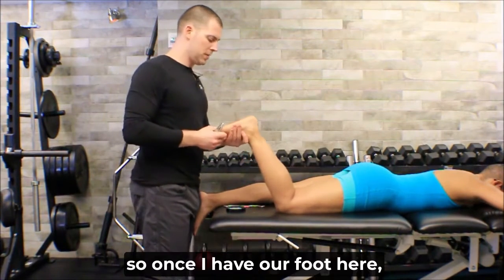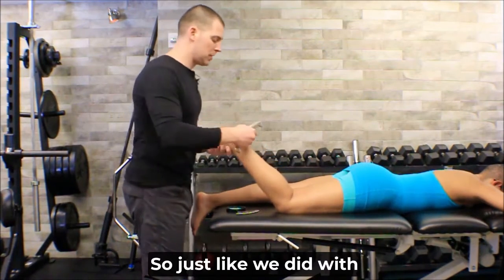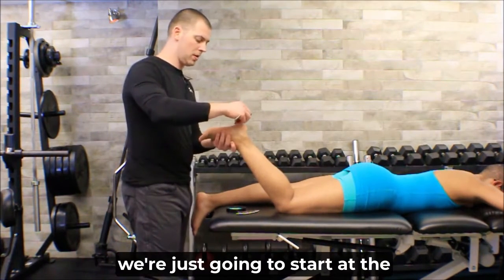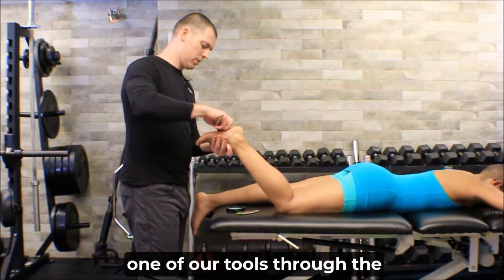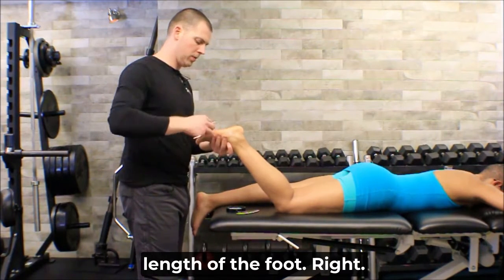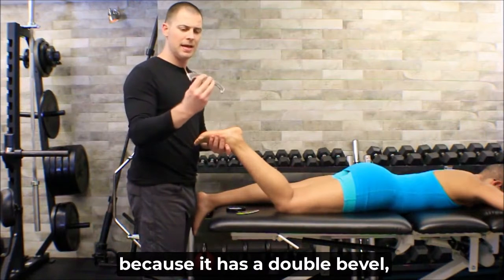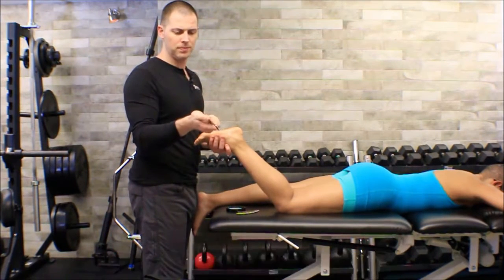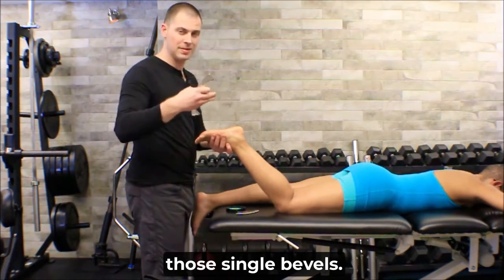All right, so once I have our foot here, the first thing we want to do is we want to scan, right? So just like we did with the crural fascia, we're just going to start at the back of the heel and run one of our tools through the length of the foot, right? And you guys can see here, I'm actually using this batwing tool because it has a double bevel, right, which means it's been shaved down from both sides, which is a little duller than those single bevels.